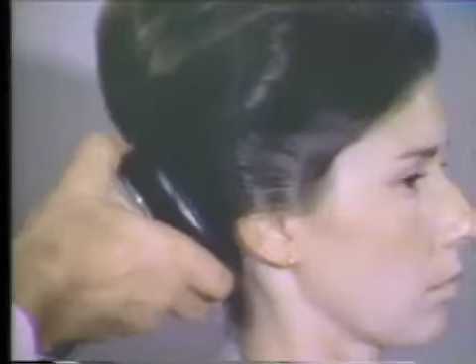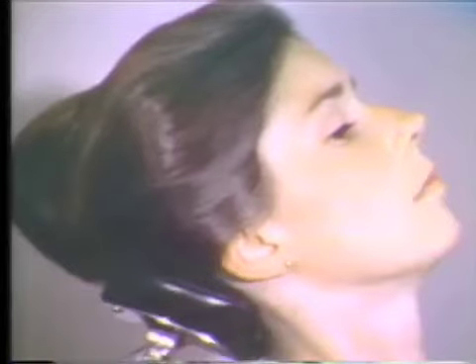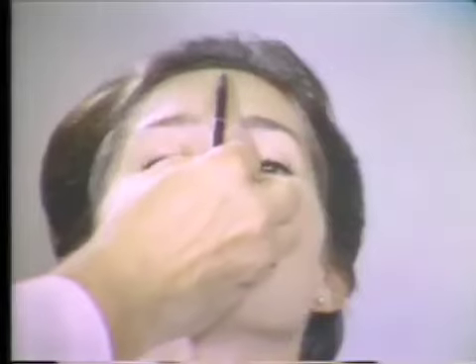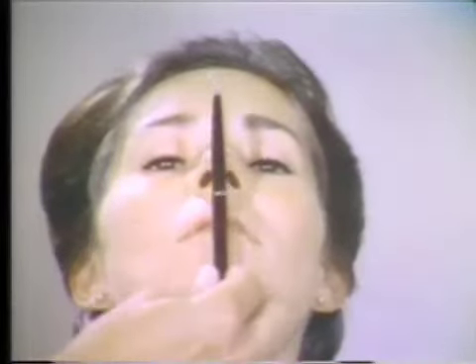For this radiograph, the patient should be positioned with her head tilted far back. The degree of backward tilt will vary from patient to patient, of course. This variance in angulation will be accommodated in the technique, as we shall see. From a frontal view, the mid-sagittal plane of the patient's head must be maintained in a vertical alignment.